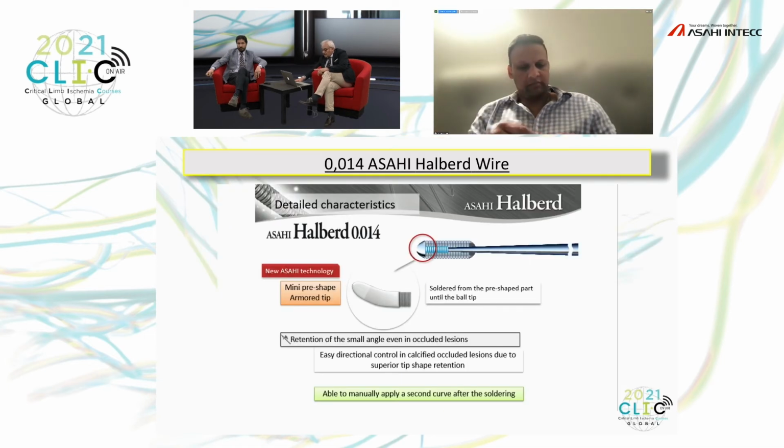But what I want to show you is the bend, the mini pre-shaped tip. This probably is the most important aspect of this wire.